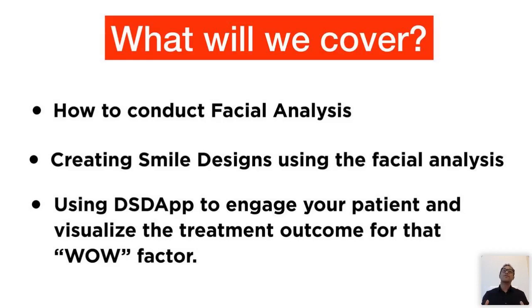And of course, it does make sense because that's the base of dentistry. But what if I told you that symmetry is not accurate for everybody? I would say over 90% of our population are not 100% symmetric. So do these rules apply to every single face? I'll make you rethink digital dentistry.